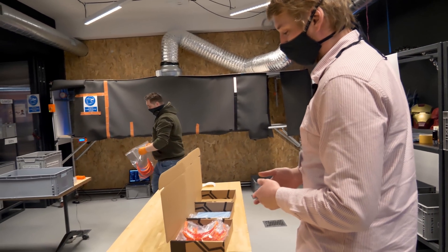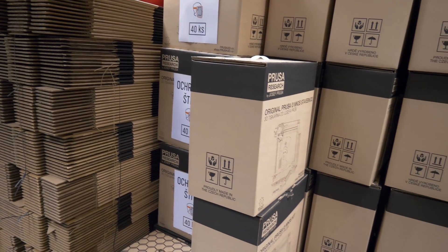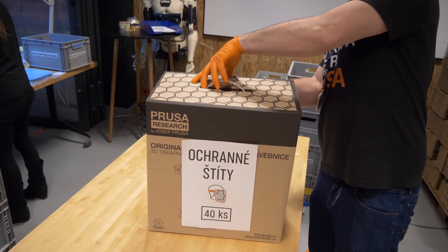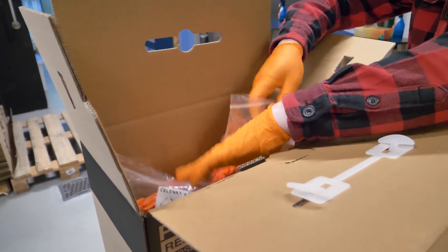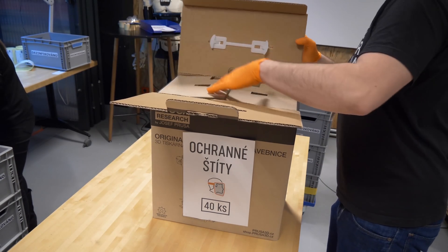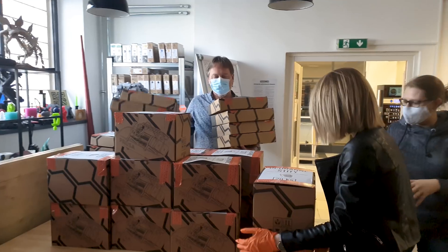We made three sizes of packaging depending on the boxes available. It really all happened in a matter of hours — we went to the warehouse, selected three boxes we normally use for our products, and made packaging of 5, 20, and 40 pieces. The operator puts all the components in the box, adds a manual, closes the box, adds stickers and a date stamp, and it goes to Expedition where it's distributed to hospitals and others in need.